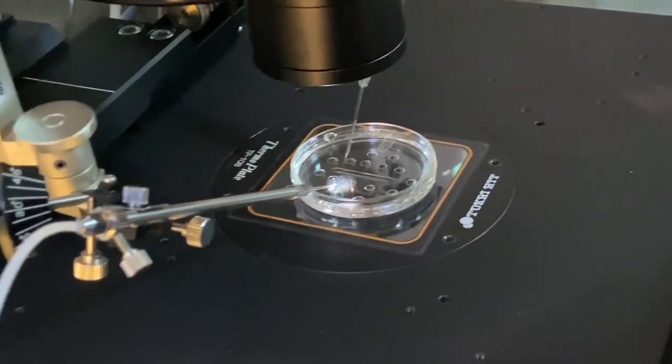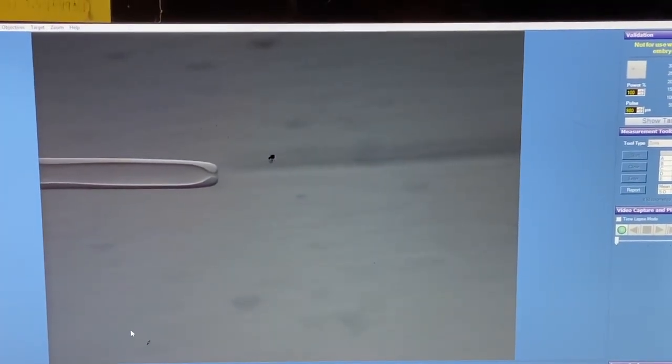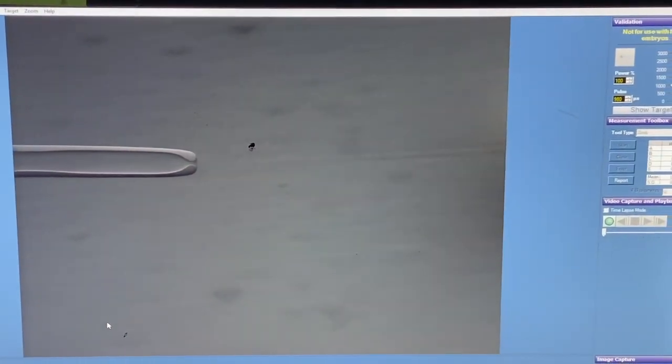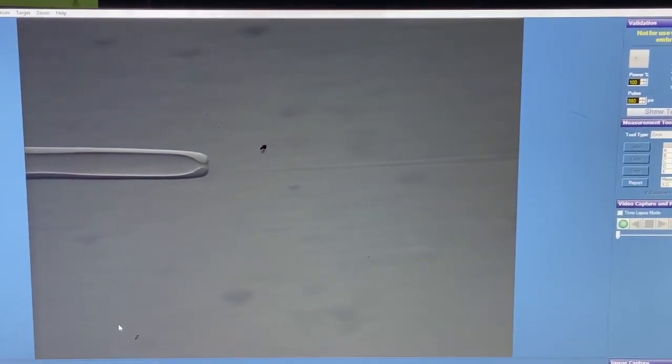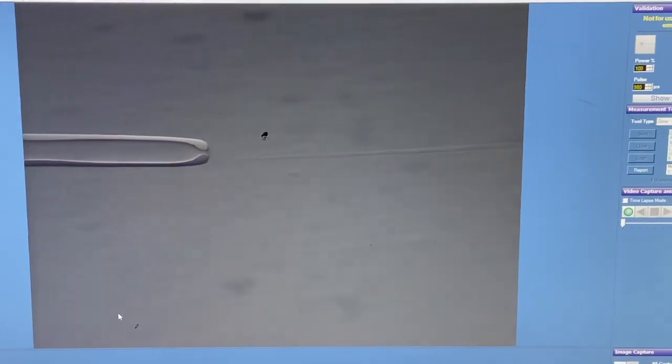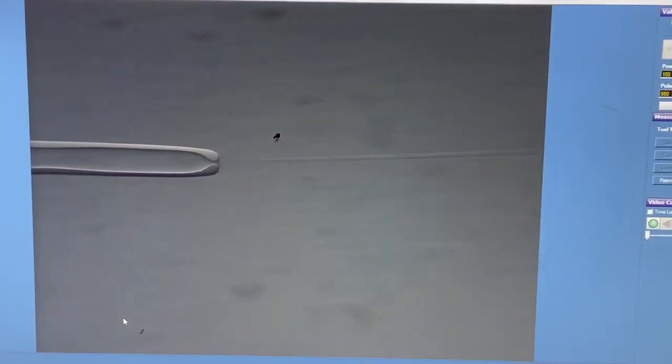You can see there now, more clearly, where I'm dropping them. This is the holding, and now I'm dropping the injecting. Slowly I'm dropping it. You can see now the injecting is becoming a little visible. Because it is all whitish, that means due to capillary action the oil is going inside.